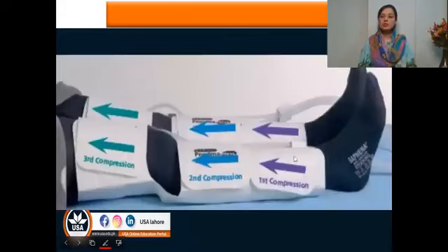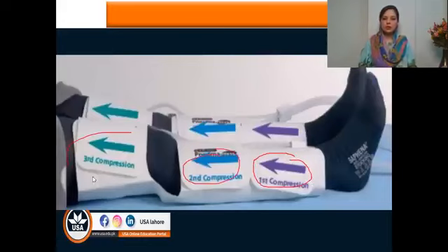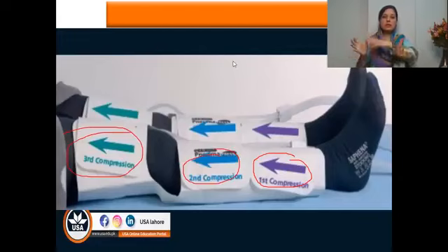This is another picture to show you. This is the first compartment, this one is the second compartment, and this one is the third compartment. Actually, we know the fluid has to move from the distal to the proximal area, so it has to move towards this area.